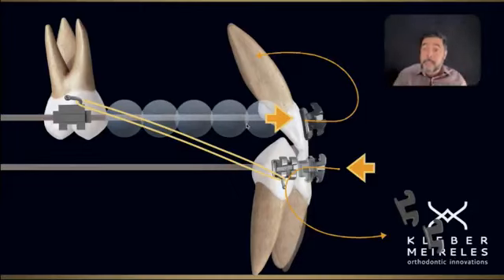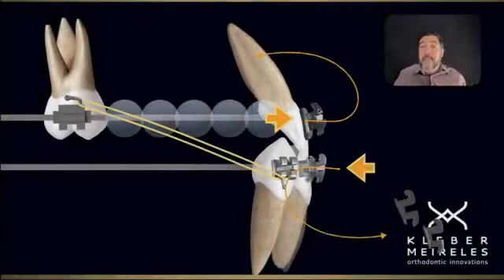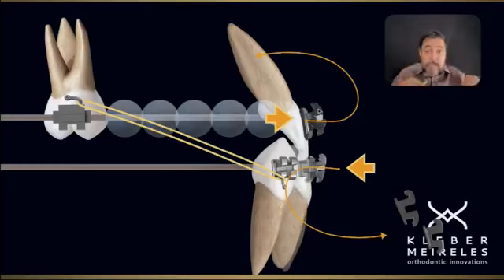But since this moment is finished, we don't have it anymore, the brackets will position anterior teeth in a difficult situation for us to compensate, because they're giving the moment that we don't want. I hope I'm being clear here. So we have the moment of the force and the moment of the couple inside the slot. Even though we didn't apply the torque, it is already there, because the moment generated by the couple inside the slot is compensating for the moment of the force.